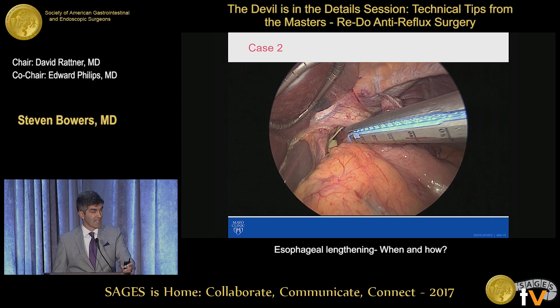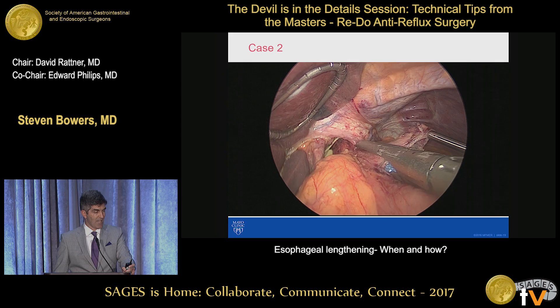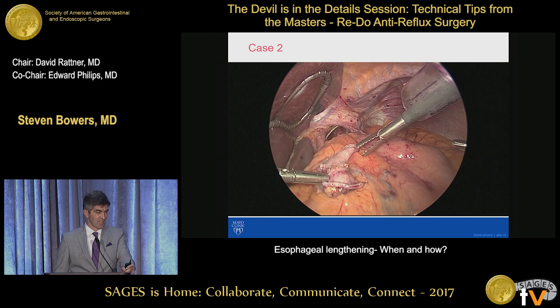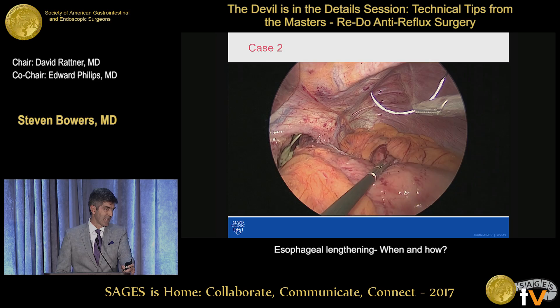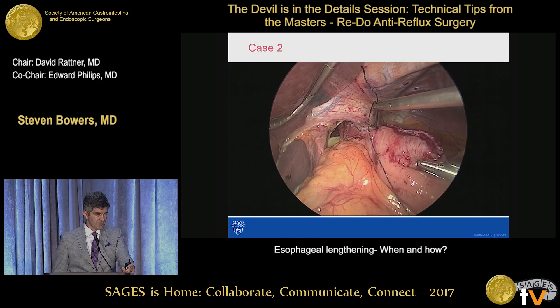And then you'll take another firing up. I don't like to close the crus before I do this, because the open crus allows you some room to get your stapler in parallel to the esophagus. Sometimes you recognize this after you've closed the crus, and you can still do it, but obviously you don't want to staple this cardia to the left crus. So then what you have is basically a triangular-shaped piece — it's about half the size of a piece of ravioli. And if you've done it like that, then you've done it right. I always take a figure-of-eight silk and just buttress that junction of those two staple lines.